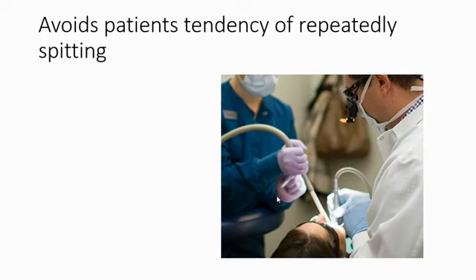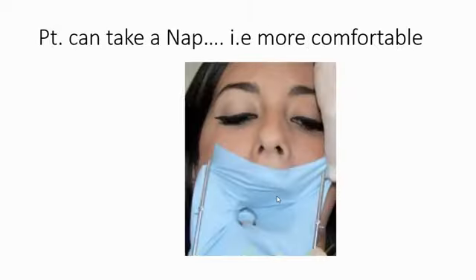And very important, avoids patient tendency to repeatedly spitting. अब जैसे मैंने अभी बोला आपको कि हम अवॉइड करेंगे पेशेंट को स्पिटून में स्पिट करने के लिए क्योंकि स्प्लैटर्स आएंगे और वो स्प्लैटर्स डायरेक्टली will have an effect on the air or the areas closer to that area. So वो जब हम avoid करेंगे तो जाहिर सी बात है you will use high vacuum suction and this tendency of patient to spit goes because you are using a dam. So tendency नहीं होगा तो एक benefit और add on है.